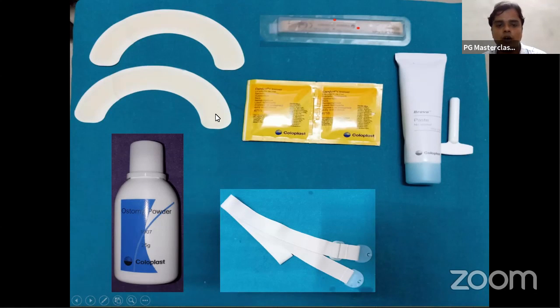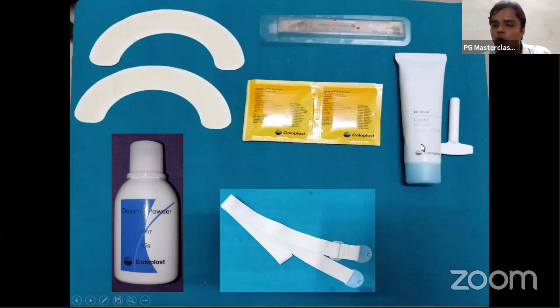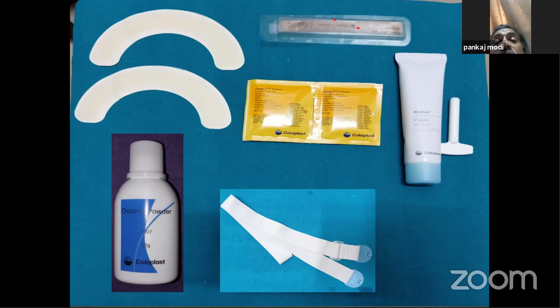What is the content in paste? Sir, paste is an alcohol based paste, sir. I have searched for more material but did not find what exactly it is made up of. Usually it is karaya gum, they call it. Yes sir, the sticking material is karaya gum. It has two parts. One is sticking, not very badly sticking.